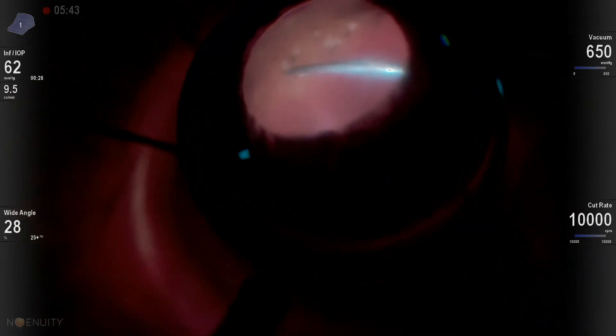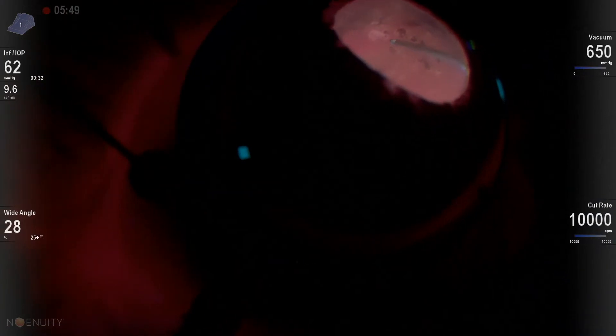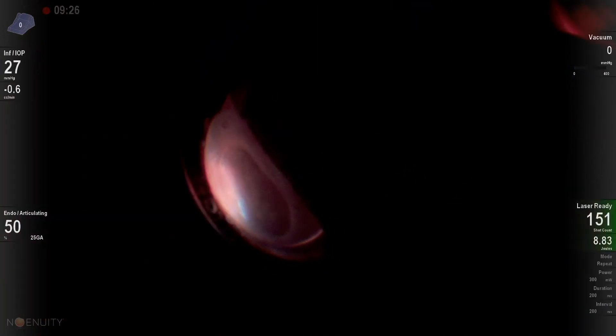In these patients who have vitreous hemorrhage, I think it's really important to get that anterior vitreous face removed. That's oftentimes where most of the hemorrhage, if it's to persist, hangs out and causes the patient issues.